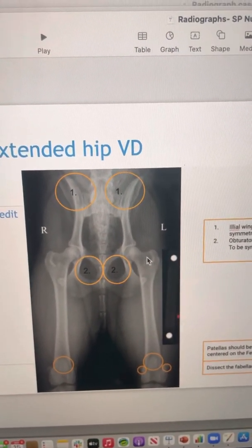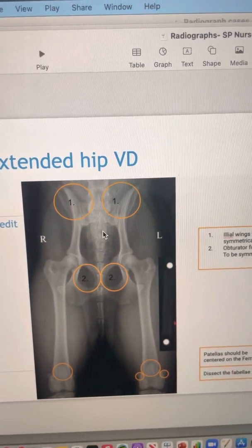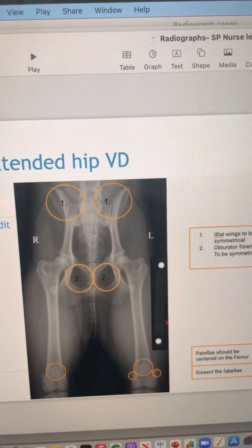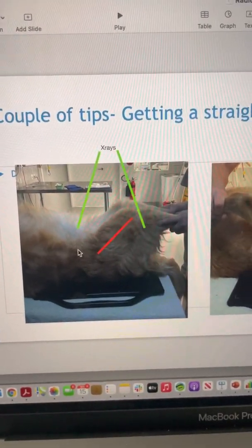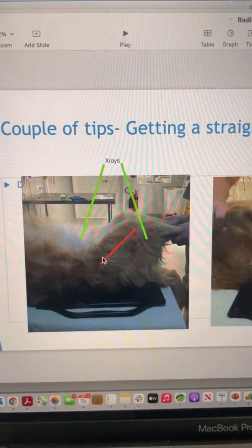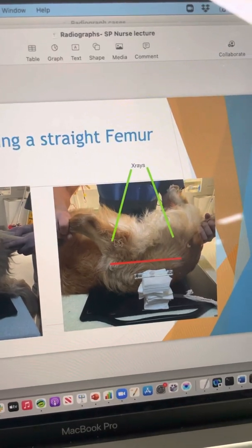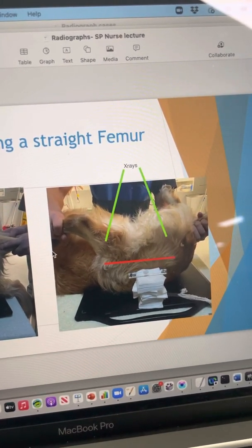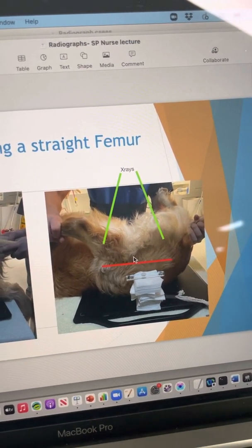That's a difficult thing to do in dogs with significant hip pain or degenerative changes. So one of the tricks I use to help with getting that femur positioned is to take what we call a caudal-to-cranial view of the femur. When we have the dog on its back with a lot of hip pathology, it's hard to extend the femur adequately to get it perpendicular to the x-ray beam coming down from the top. So what we can do is pull the femur cranially so it lies along the side of the dog, and the femur is now perpendicular to the x-ray beam — giving us a nice straight view.